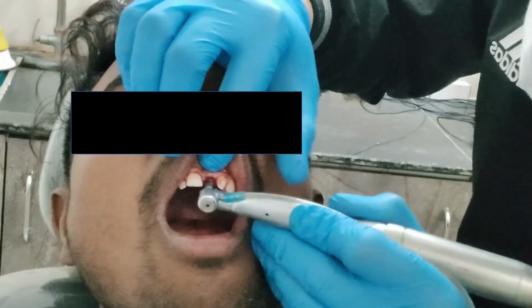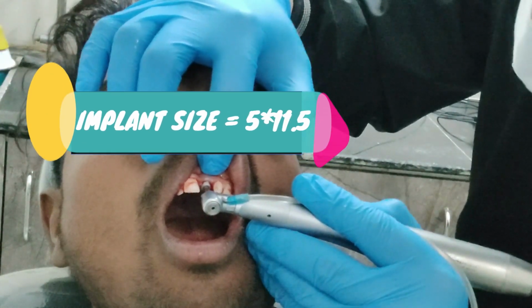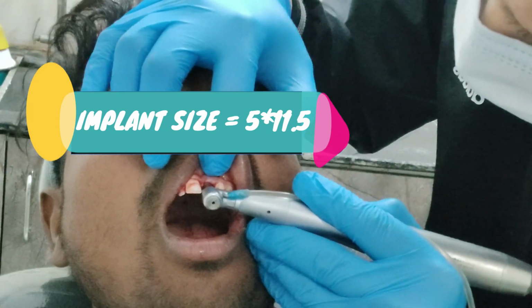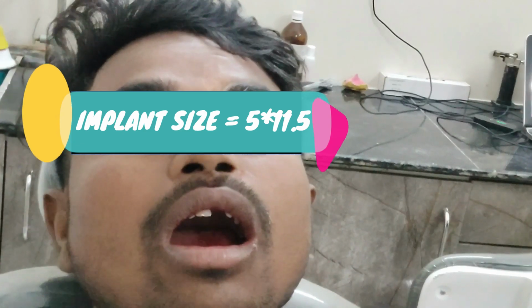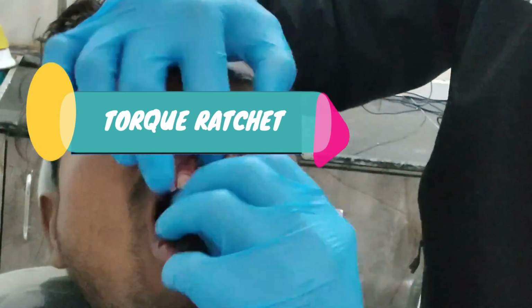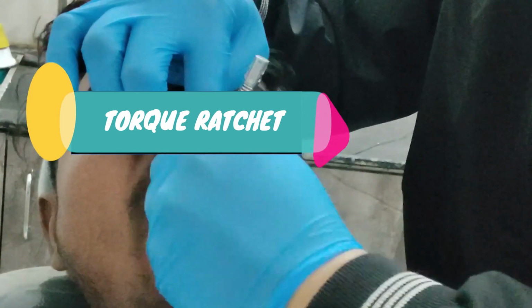After completion of drilling, now we are going to place an implant of size 5 x 11.5 with the handpiece into the drilled socket. Because the width of the implant is 5 mm, we are going to use the last drill of 4.4 mm so that the implant will fit snugly. Now we are going to further tighten the implant with the help of a torque ratchet so that we can maintain the torque. As you can see in the video, we are using a torque ratchet with a hex at the apex.